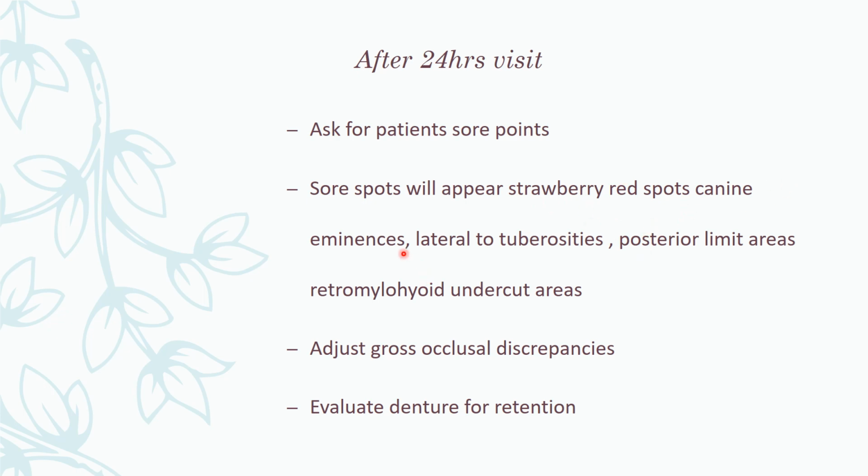Spots near the canine eminence, any lateral tuberosities, posterior limit areas, retromylohyoid undercut area, anything has to be trimmed off, relieved basically. Any gross occlusal discrepancies have to be adjusted and evaluated.